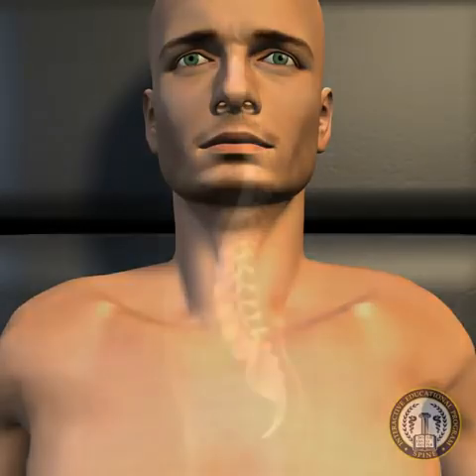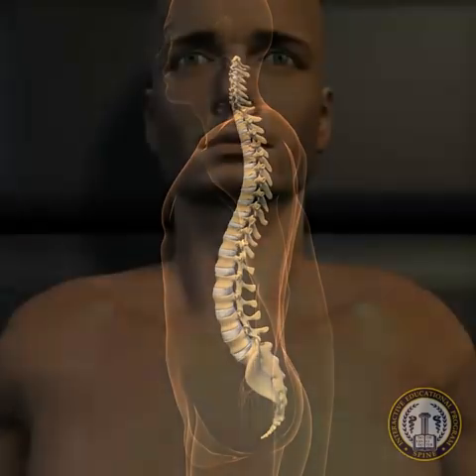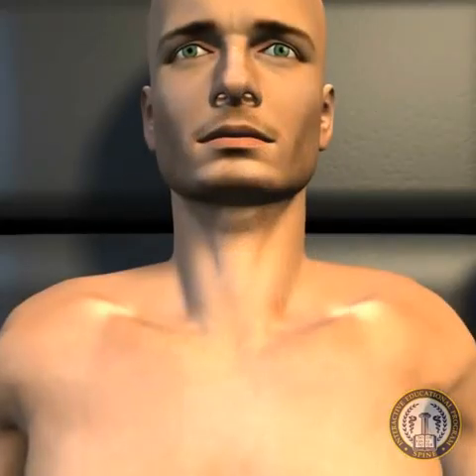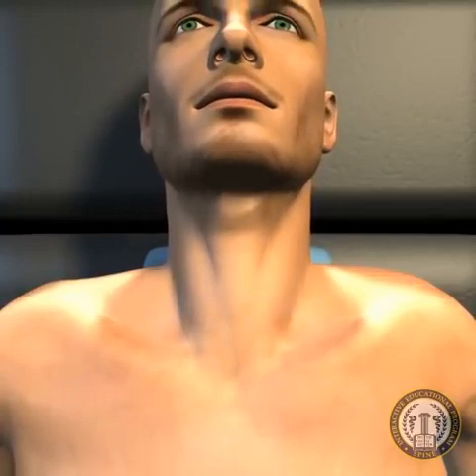Optimal positioning of the implant should reproduce the natural lordosis of the disc space to be replaced. To achieve this, gentle extension of the neck with a roll underneath the shoulders is performed. Remember, cervical myelopathy can be acutely worsened by this position.